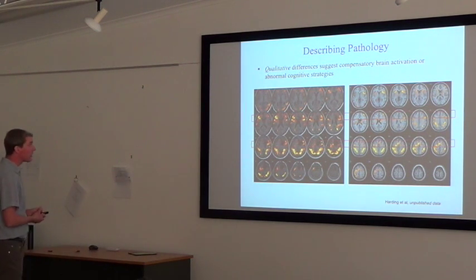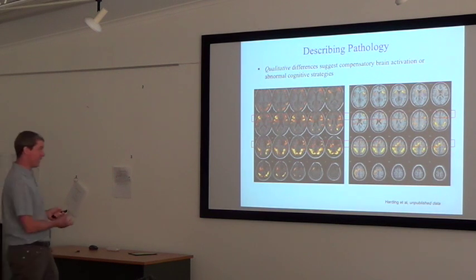These blob maps no longer look the same, in posterior structures certainly. But if you see here, where you have a lot of lateral prefrontal activity, we don't really see that lateral prefrontal activity in controls. Whereas, obviously, you see the medial activity here, he doesn't even have brain tissue there in order to do it.